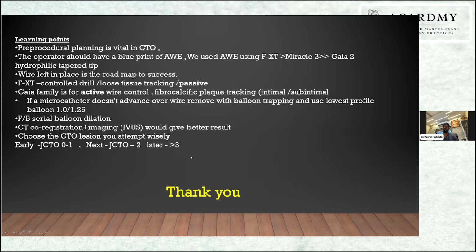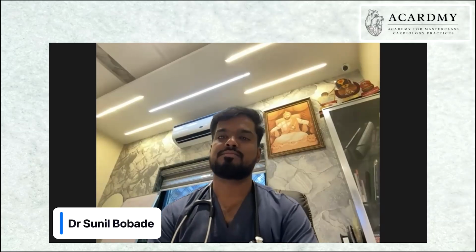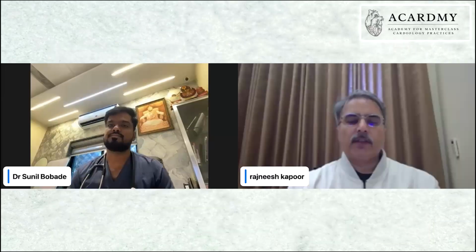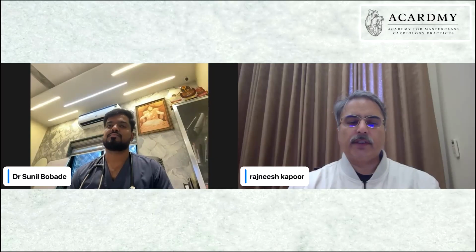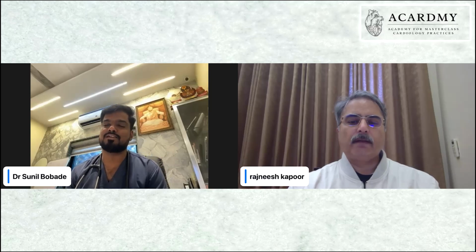Very nice, Sunil. Very nice. I feel a lot of pride to see how our complex interventions are being done in every nook and corner of the country. Such cases require good endeavor, good planning, and obviously some audacity to plan and execute. So very well done. Just keeping the algorithm in mind, I just followed the steps of the algorithm.